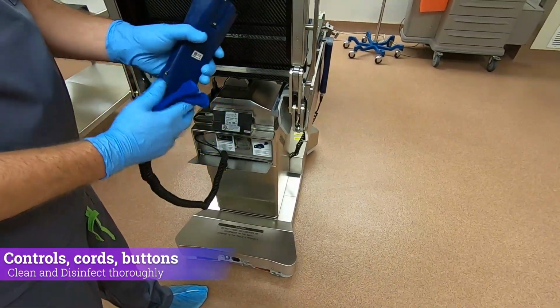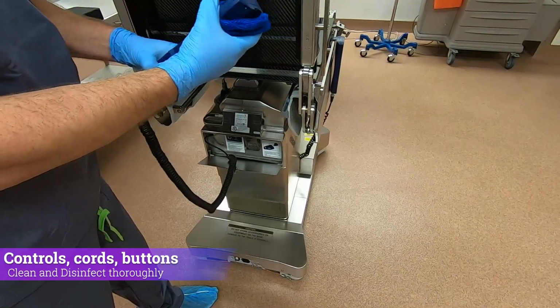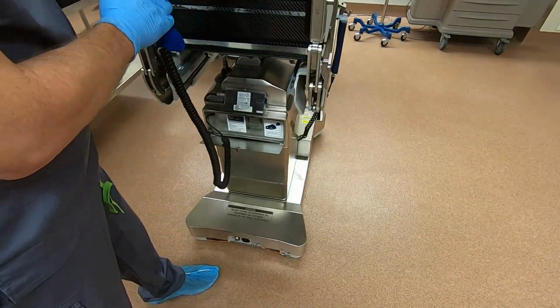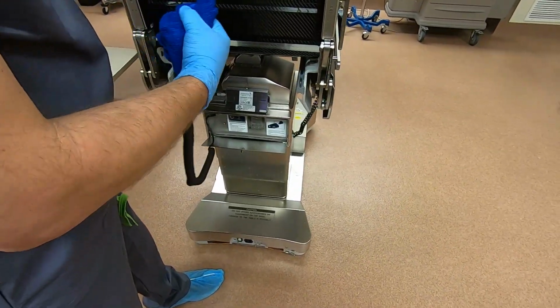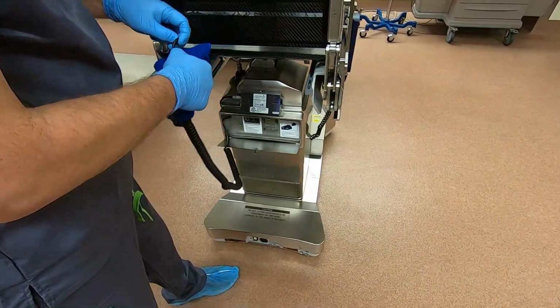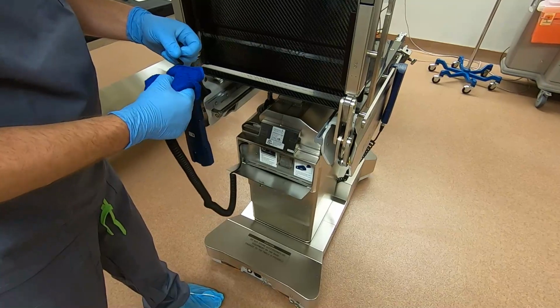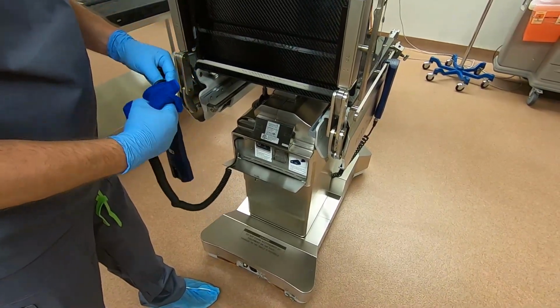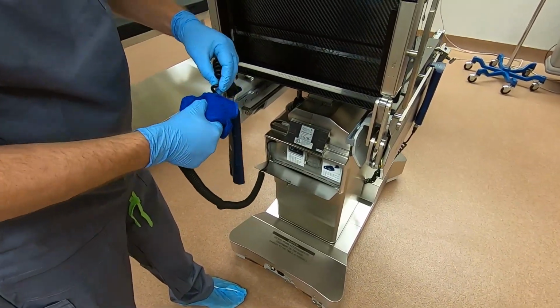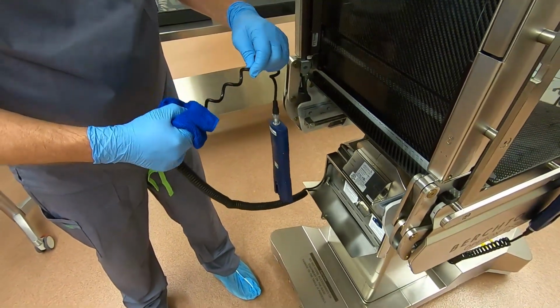Remember to consistently and constantly refold the towel so that the wiper has a fresh, clean surface upon which you can clean and disinfect. This ensures there is no cross-contamination and the highest log reduction for microbial removal. By utilizing a clean, fresh surface and utilizing all 8 sides, you not only are maximizing the efficacy of the wipe, but you're saving money and the environment.